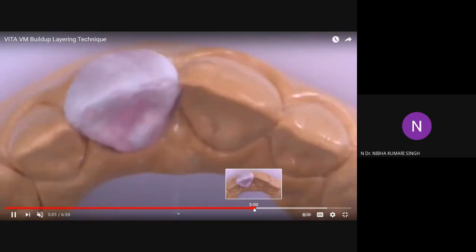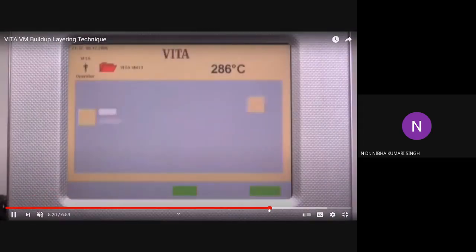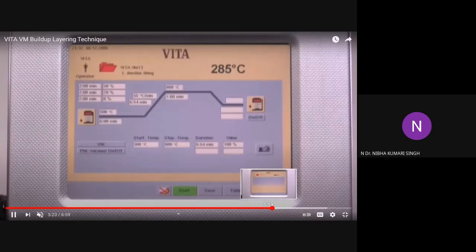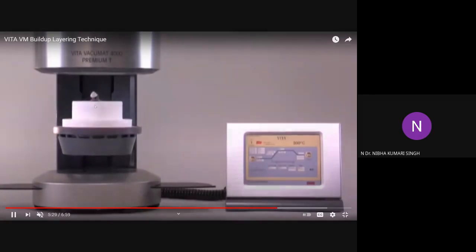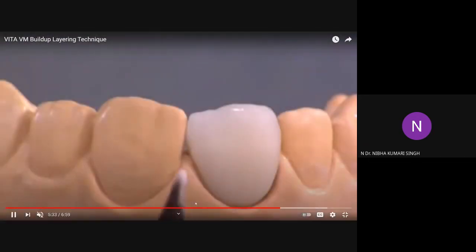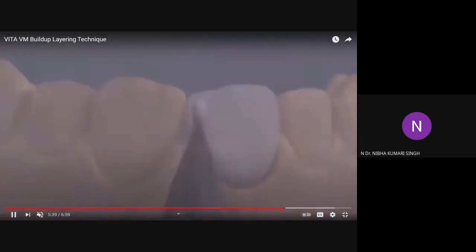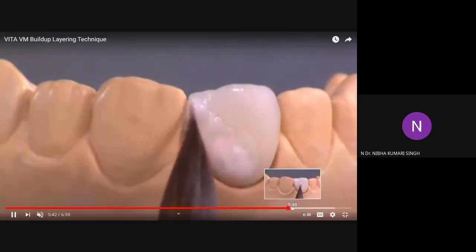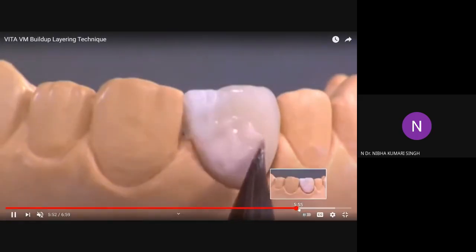So this is how they have fabricated it. After they removed it from the tooth, they are contouring the proximal surfaces which have gaps. And these are the firings which they are adjusting on the Vita furnace. This is available in our department also, the vertical opening Vita furnace. You can see after firing how it has become like a normal thing. The volume has decreased because of the shrinkage, because of the sintering process which took place.